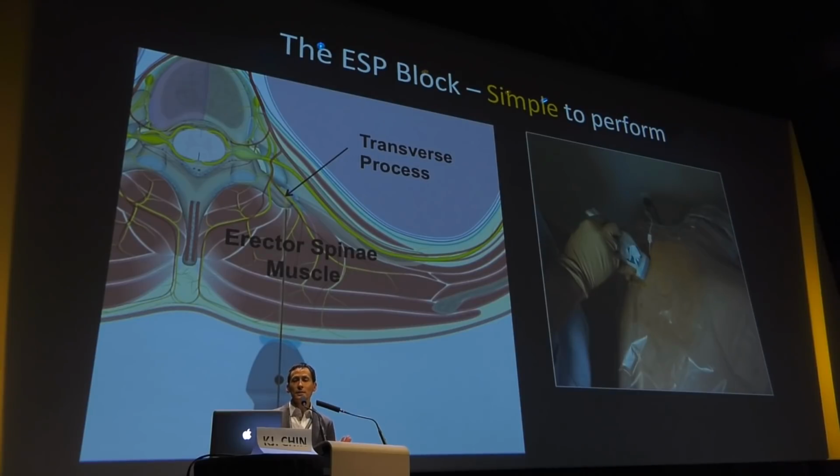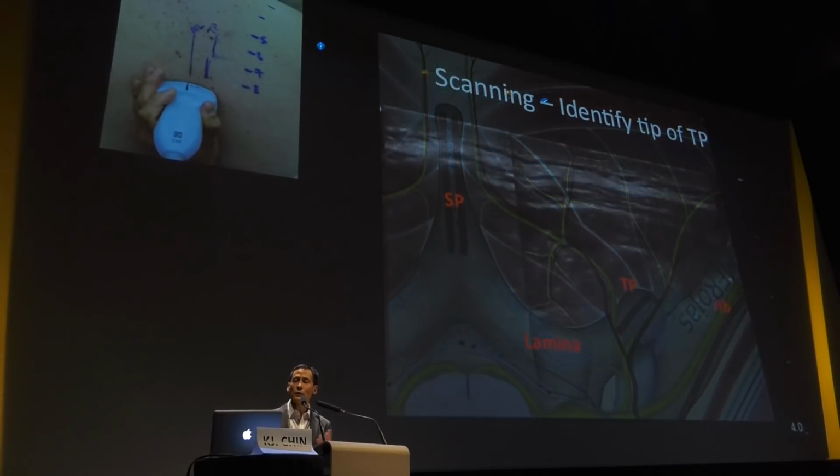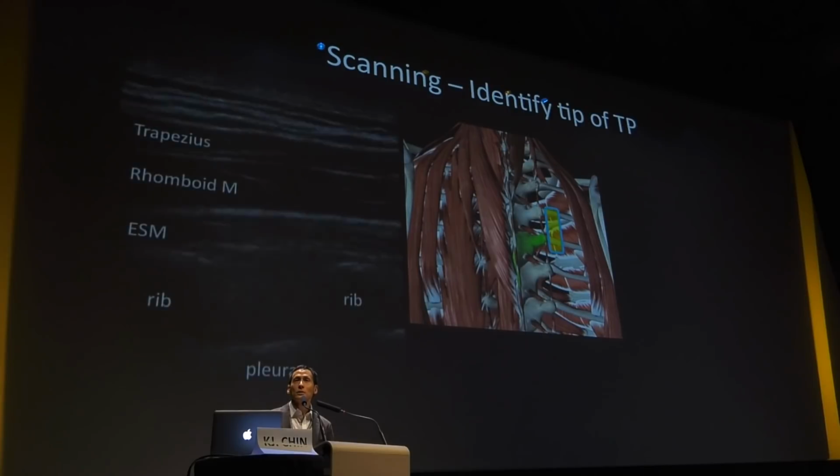It's an ultrasound-guided technique because we're trying to find the transverse process, but the scanning is very, very easy. I often recommend that people start with a transverse scan because then you can easily pick up the tip of the transverse process. And it's a shallow structure, especially at T4, T5, and easy to identify. And once you've found it, you can mark it on the skin.